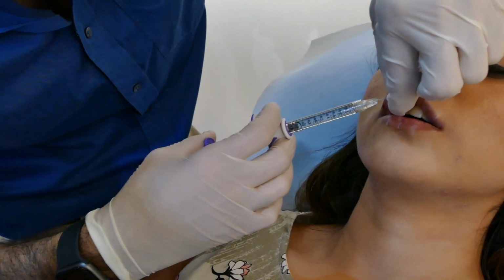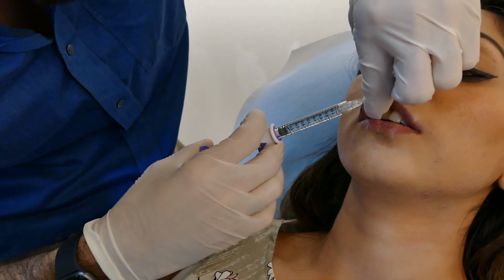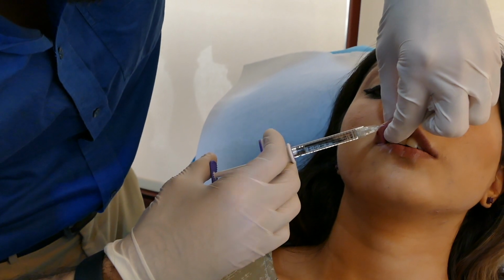So he started injecting in the lateral part of the right side of the upper lip, then in the middle part of the upper lip. So each side about 0.1 ml is injected.